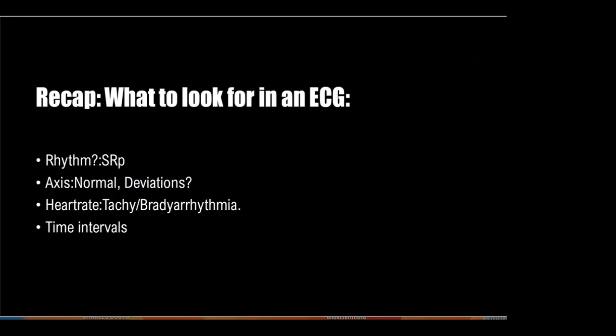If you have a working piece of paper, you can draw your ECG, like the P wave, then you can name it P, QRS, and do the next cycle. So basically, for you to have a sinus rhythm, you have to have a P wave and a QRS complex, and each and every P wave has to be followed by a QRS complex. That's the first criterion for finding out if you have a sinus rhythm.